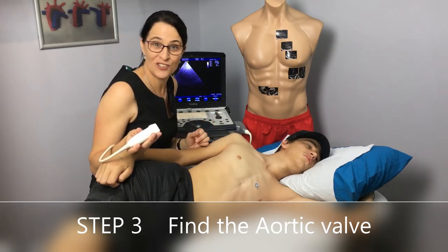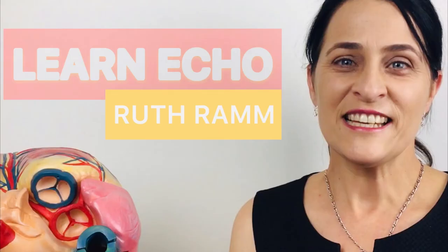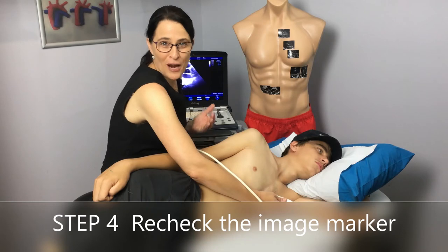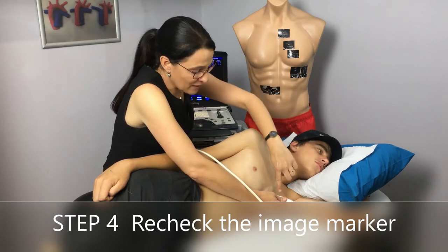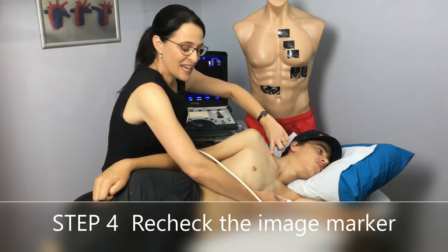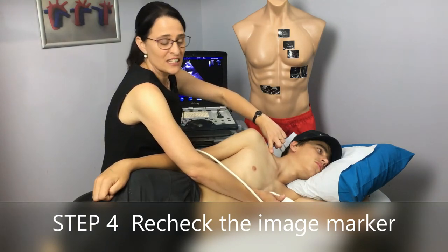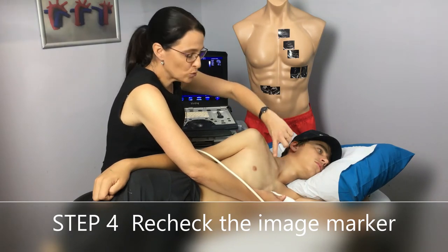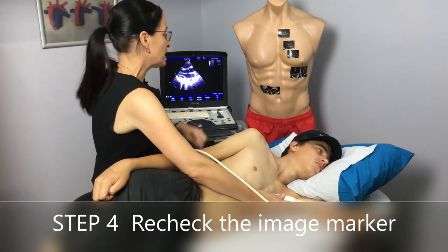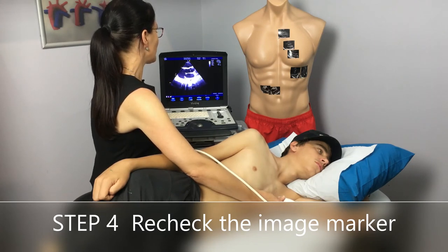It's important to remember where the aortic valve is located — the only things you're allowed to do are tilt up or tilt down, nothing else. Step number four: recheck the image marker. For the parasternal long axis image, the image marker needs to be pointing towards the mid-clavicular region of the right shoulder. When we're learning it's very easy to rotate the transducer unnecessarily, so recheck that your image marker is pointing towards that mid-clavicular region.